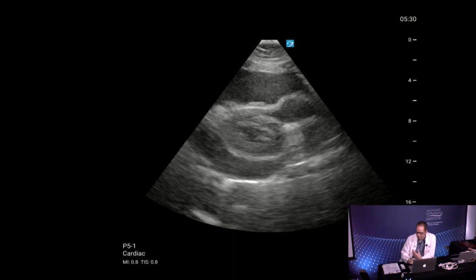I know some people have a mindset that ultrasound may slow me down. I have to put in an order to get the patient's information into the machine or enter it manually. But in a lot of cases for resuscitation, it'll really speed up your time to disposition, and it really guides your workup. Did she need the sepsis fluids? Maybe not. We probably just need to relieve the strain on her heart. Did she need all the antibiotics? Maybe, maybe not. She had an elevated white blood cell count, but really no source. So a lot of good things can come from using ultrasound in resuscitation.